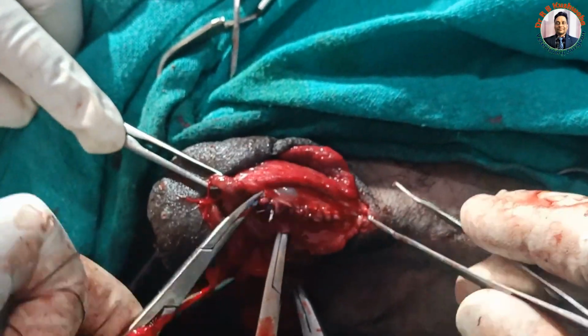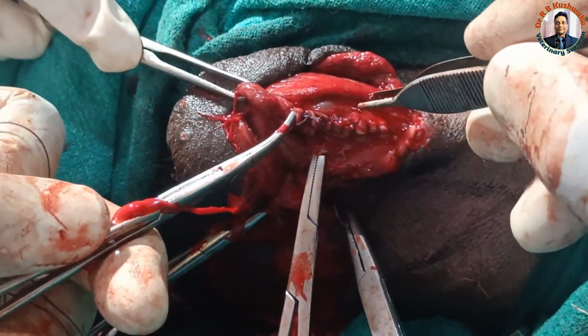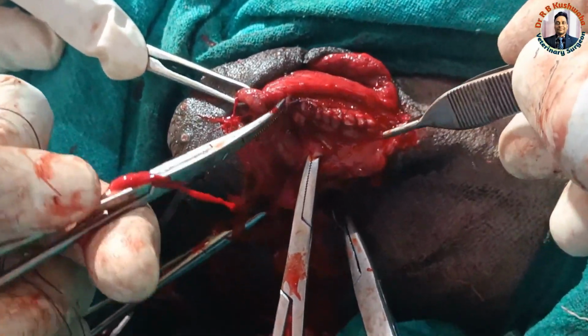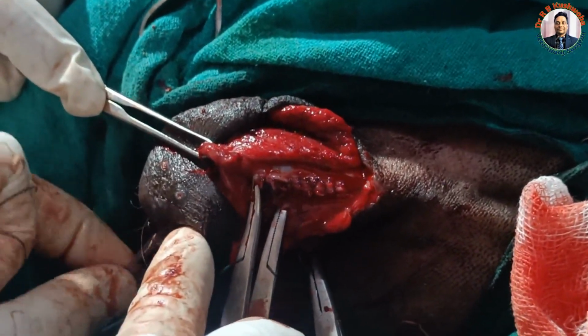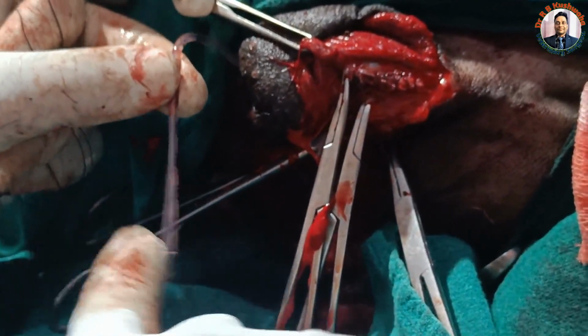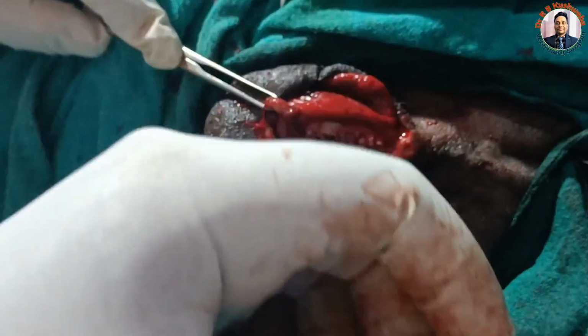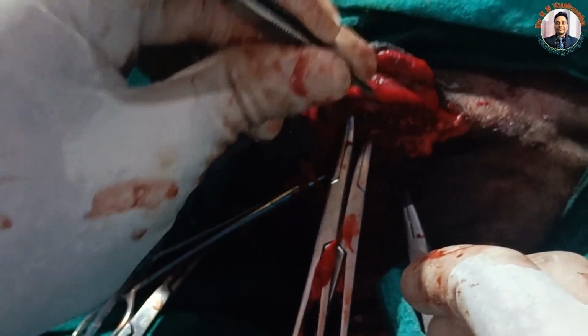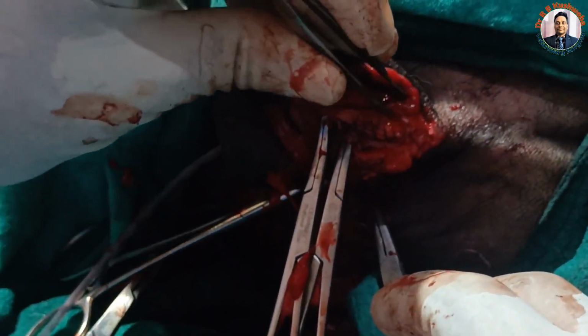So now you could see we have repaired this urethra. Now you could see the catheter is not visible because we covered the catheter from the other side, the inside urethra. So in this way we prepared this urethra. Now the urine will come from here and ultimately come through this. Now you could see the urine is also coming through this catheter. So next step, we will excise this urethra because this just acts like an epithelium. So we have to remove this one.